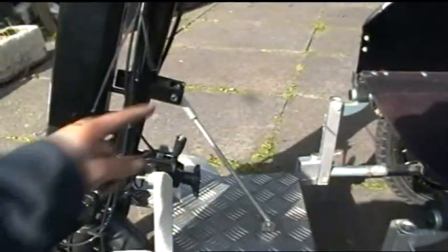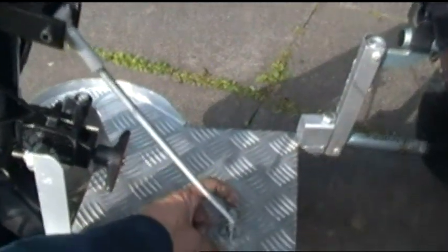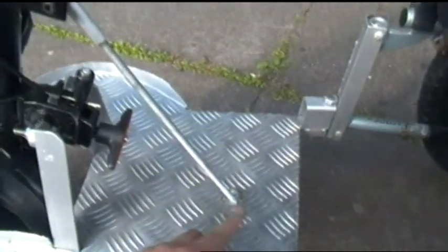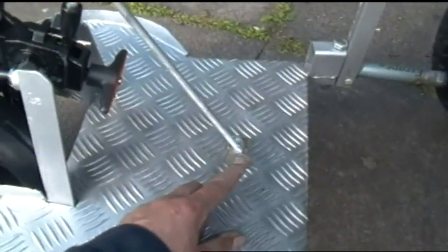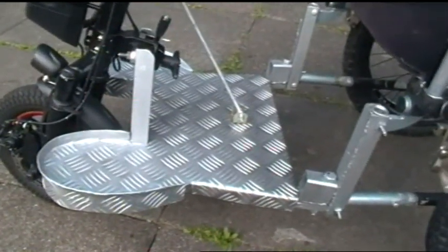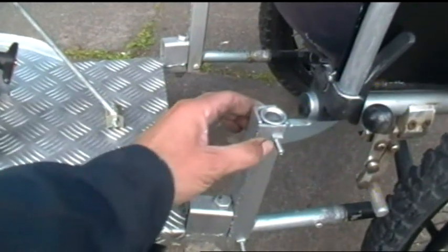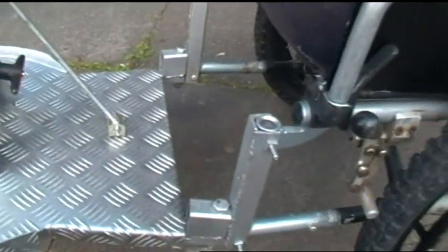So what I'm thinking is I probably need to change something around here, maybe put some sort of bolt with a wing head on top there and a wing nut on that side, so that it can be taken out very easily. That's the sort of quickest option. I need to change these bolts here and put shorter bolts in with nylock nuts on so they don't come loose.